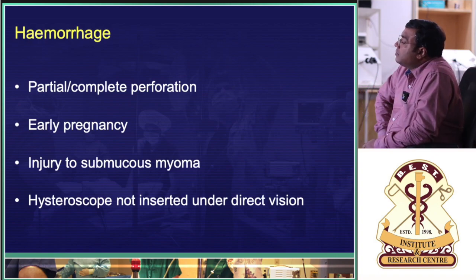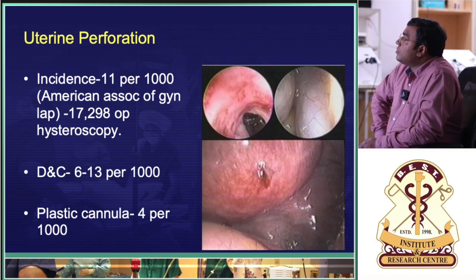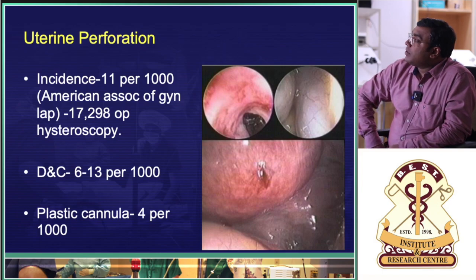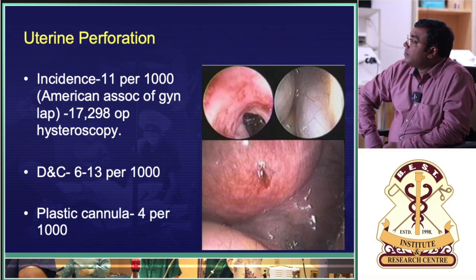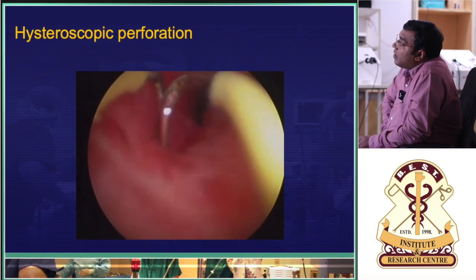See, there is a perforation here, and again here also. So you have to be extremely cautious. So this is a Collins knife.